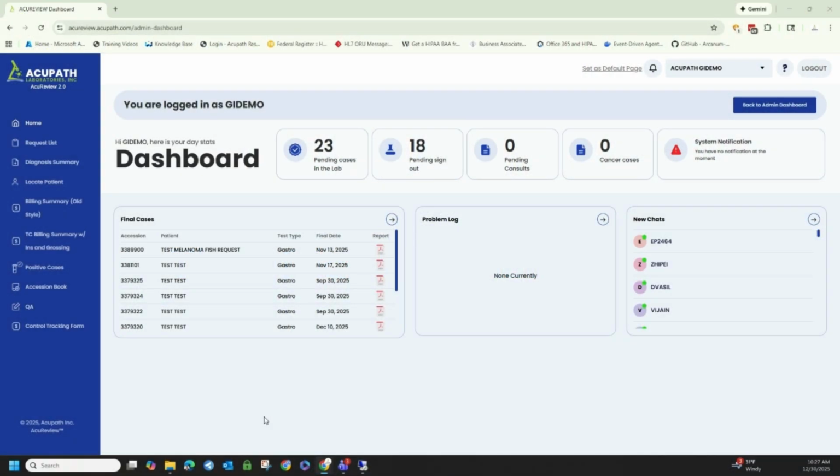In this AcuReview 2 training video, we're going to go over the Office user role in AcuReview 2. Office user is a new role for us because in AcuReview 1, which was created for pathologists, there had never been any thought of Office user. The only type of office user that AcuReview 1 has is a pathologist user, and that's it.